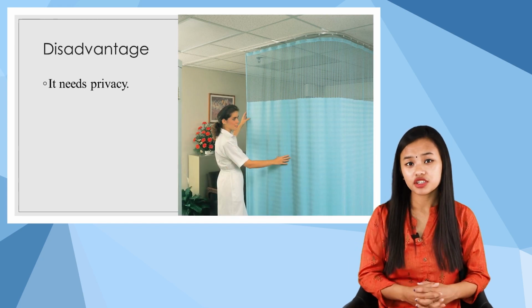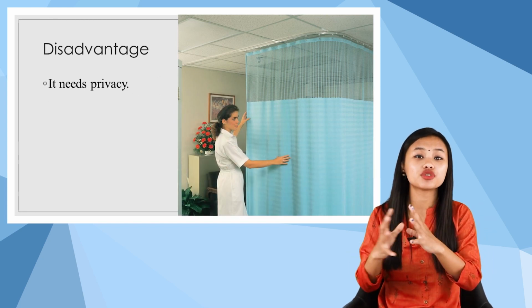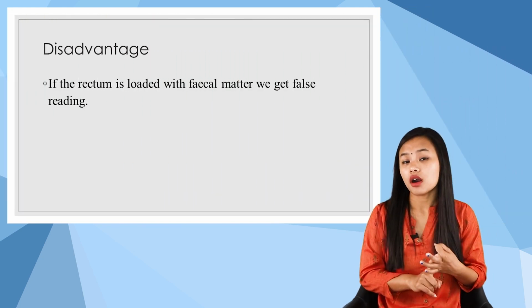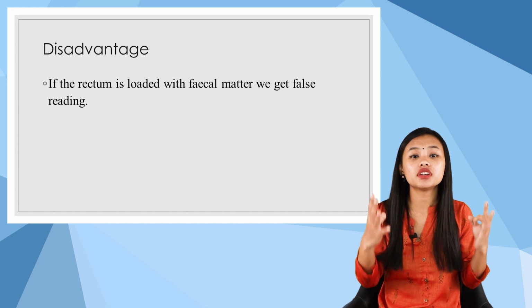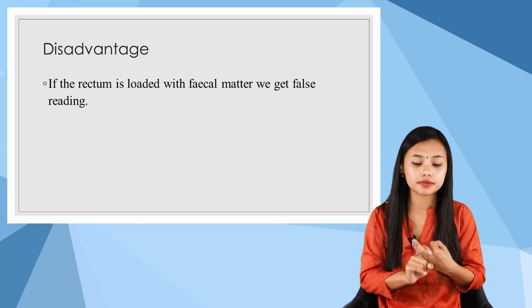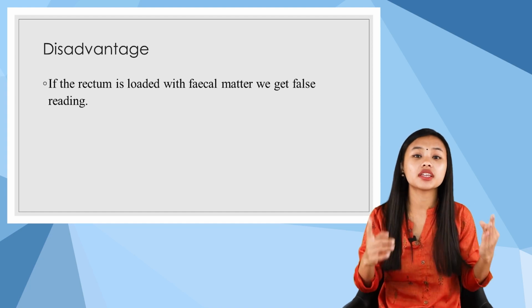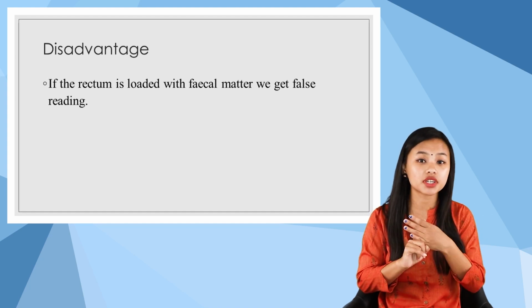What are the disadvantages? Assessing the temperature through the rectum requires the privacy of the client. There are also high chances of the nurse's hands getting soiled. And also, if the rectum is loaded with fecal matter, it can give us a false reading.